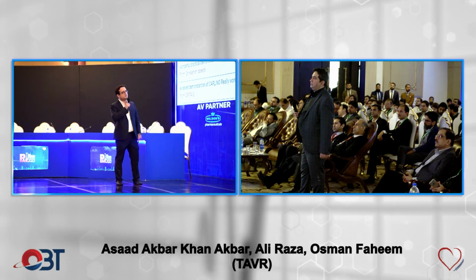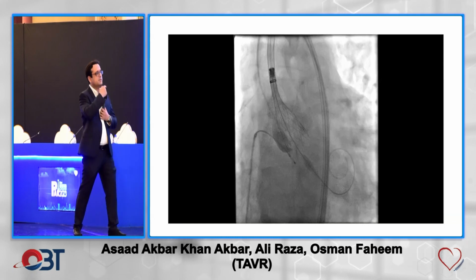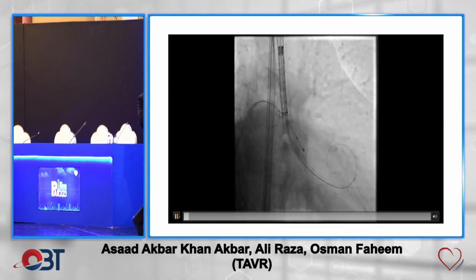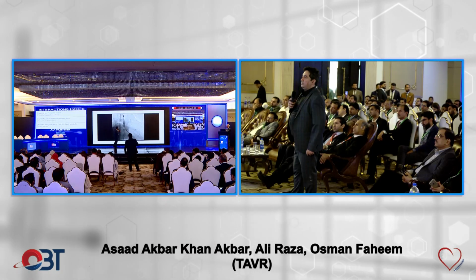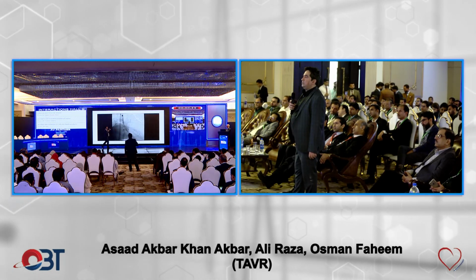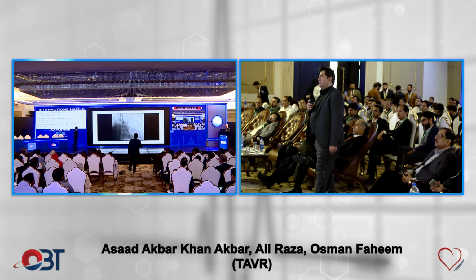Usman, go to the previous slide, and show them the parallax one as well, how you removed it. Which one? The previous slide? I think he didn't store the... There it is. Remember we were talking yesterday, me and Ali, that this doesn't need a lot of discussion because you will learn it as you go along. But the bottom part of it should not look like a circle. It should look like a flat line, so that they are behind each other, for you to start deploying this valve.